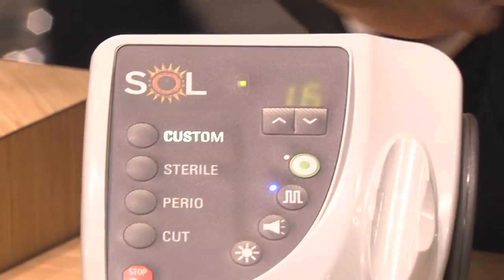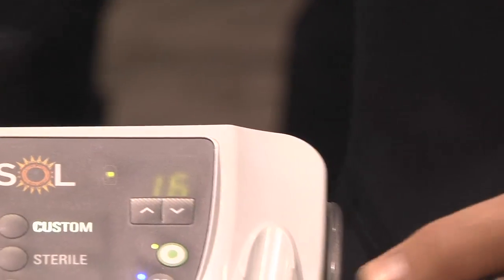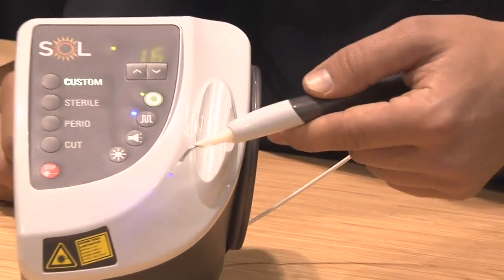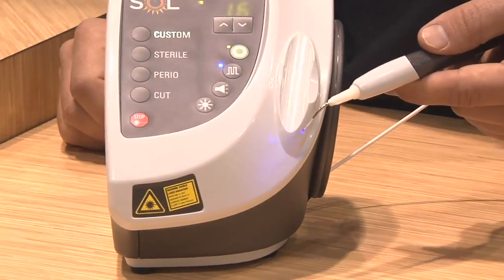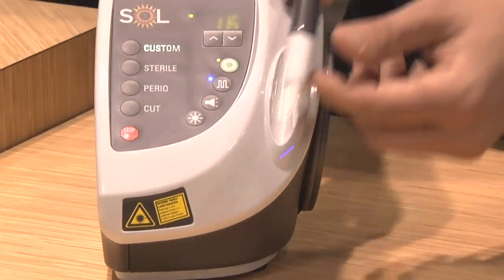Another feature that the Sol laser has is a blue aiming beam — dentistry's first blue aiming beam. Traditionally lasers have a red beam, which can be very difficult to see when you're shining through blood on red tissue or inside the periodontal pocket. Denmat has introduced a blue beam, which provides enhanced visibility and contrast, especially when working through blood or on red tissue.